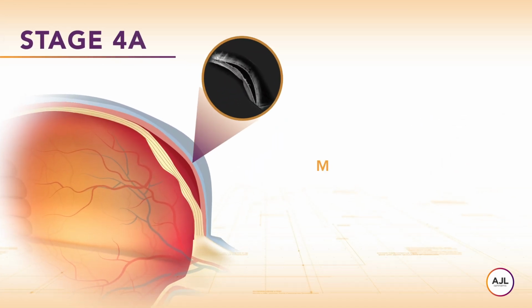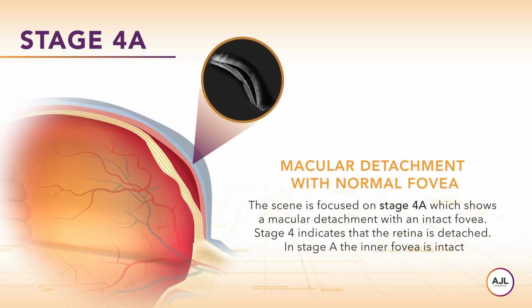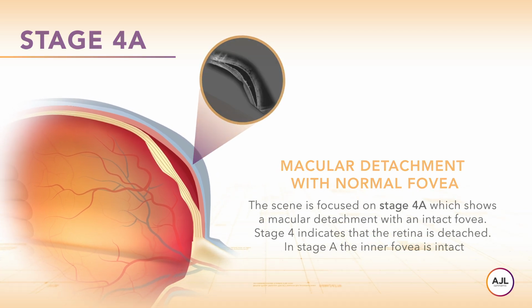The scene is focused on stage 4A, which shows a macular detachment with an intact fovea. Stage 4 indicates that the retina is detached. In stage A, the inner fovea is intact.